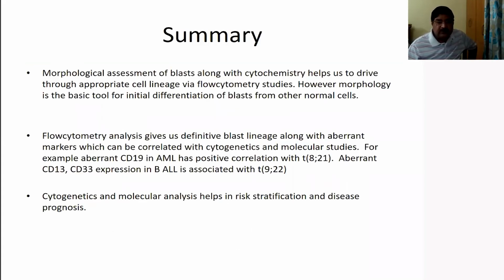So to summarize, the diagnosis of acute leukemia in the current era is becoming highly complex because you have to employ a multimodality diagnostic approach by employing multiple techniques, right from morphology to flow cytometry to cytogenetics to molecular genetics. So I need not overemphasize that. And as the WHO classification evolves, it has become more and more complex for developing countries to adopt the various techniques that they pronounce.